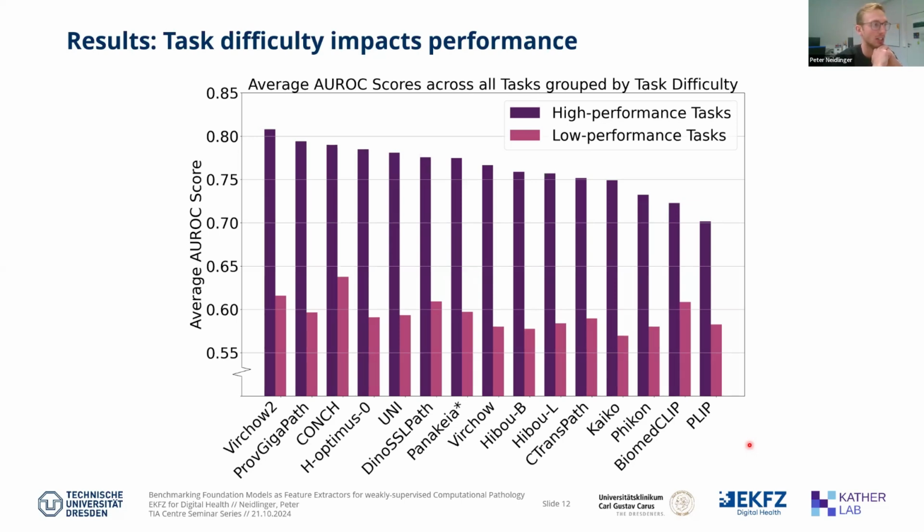Of course, some of the biomarkers might not lead to morphological changes that are detectable, or only very small changes that are very hard to find, and then the performance might be lower. Or if there are no detectable morphological changes and it's mainly just a confounder, then it also depends on how often the confounder and the actual label you're trying to predict align.